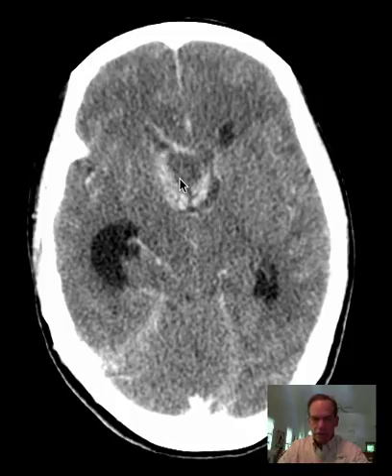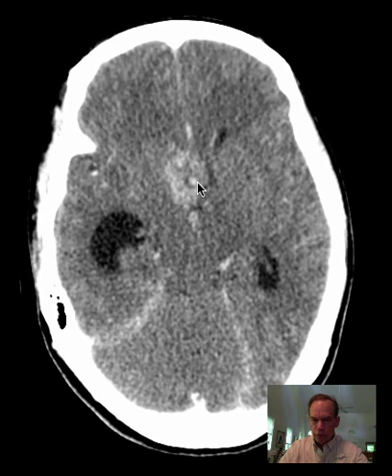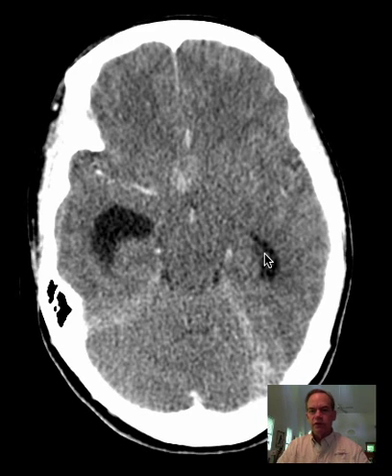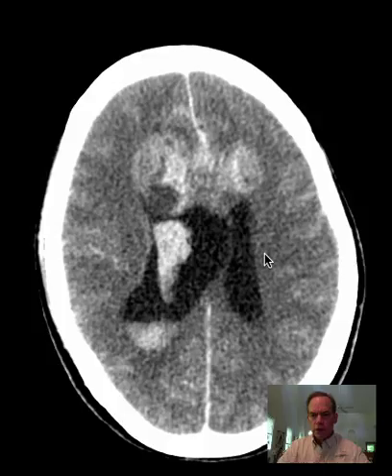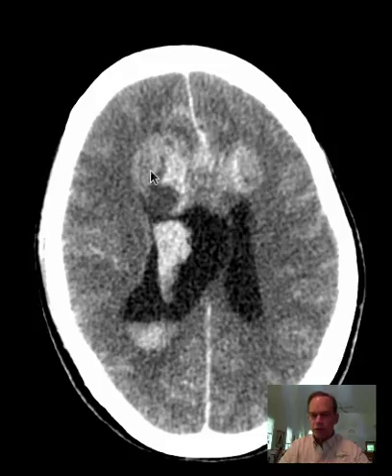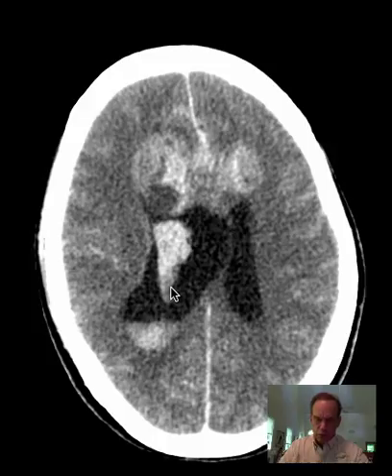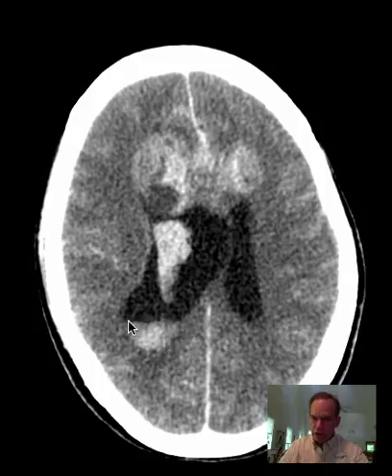There is at least partial obstruction of the cerebrospinal fluid flow at this point, with resultant enlargement of the temporal horns of the lateral ventricles, more so on the right than the left. There is high attenuation material extending inferiorly from the right component of the mass, along with layering blood in the dependent aspect of the right lateral ventricle.